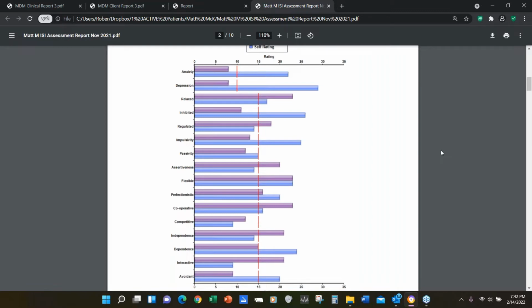But when I think about what relates to what I'm going to see on the map, yes, I think I'm going to see the anxiety and depression. And I may say, I'll show you this on the map because it's probably there. But the physiology will definitely be there and strengthen the holistic approach that I'm going to be advocating for. That's what I mean. I go over the ISI, the physiology, and the CEC before I go over the map. And in fact, I'm only going to go over a map once they've completed it.